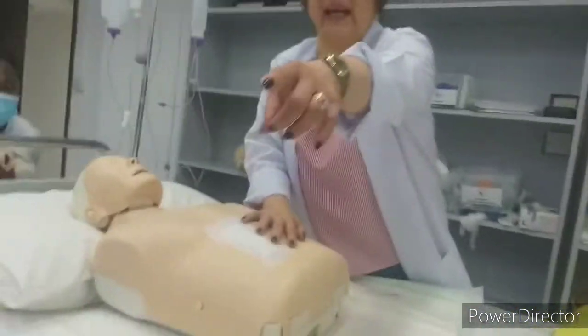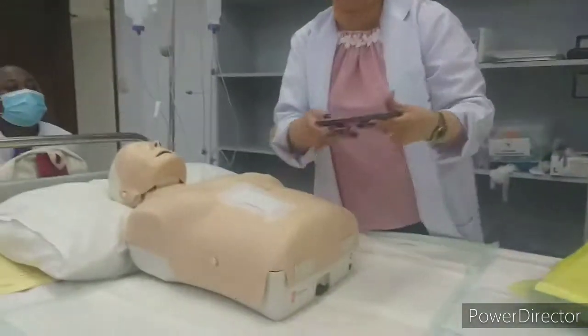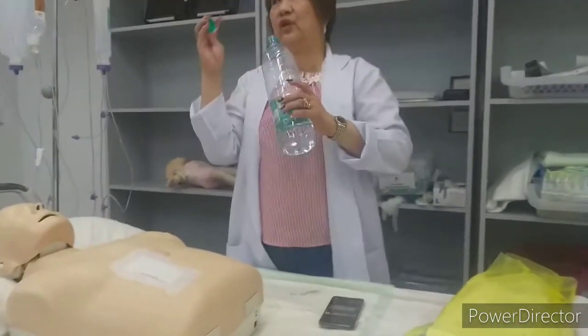peg care. Can I have my telephone? Plus the water, please. Can you? Okay. I will show you a peg care. A peg. You have seen the peg?